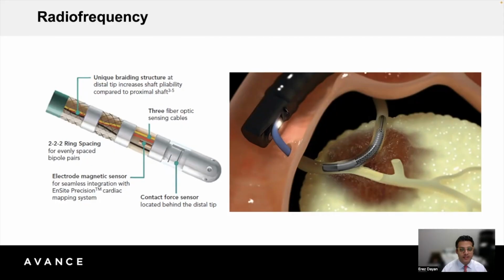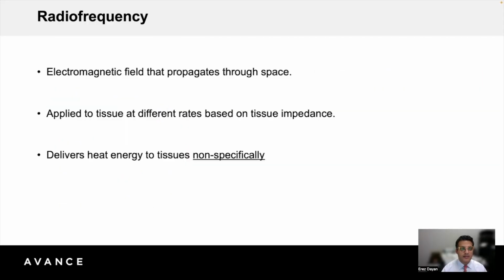And radiofrequency has really emerged as one of the leading technologies. It's a very familiar technology. It's existed for almost 100 years in different forms. It's entered the aesthetic space in the last 25 years or so. And what's nice about it is it's non-specific. So you can apply this technology to any Fitzpatrick type. And all it is, is an electrical current that travels through tissue.